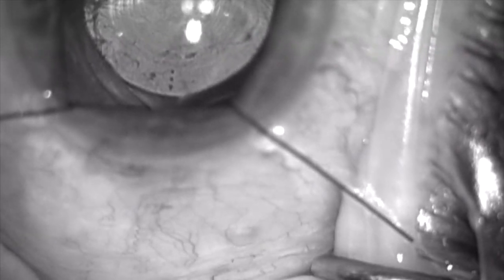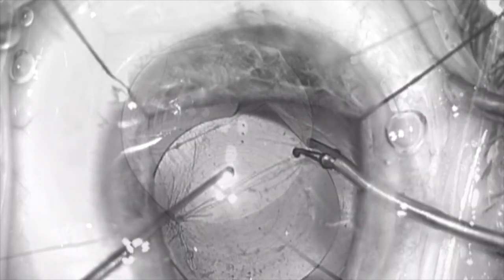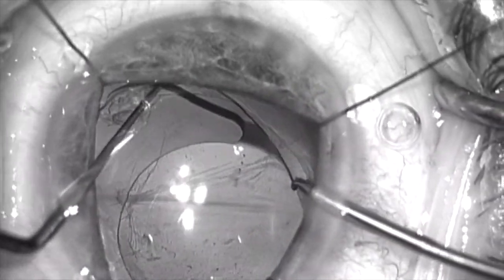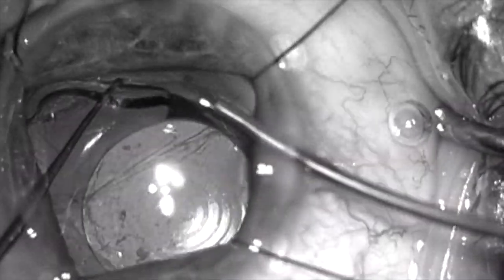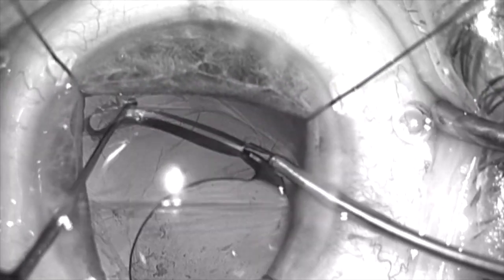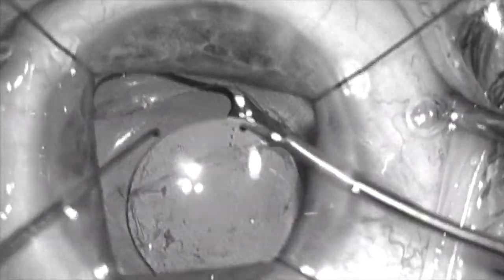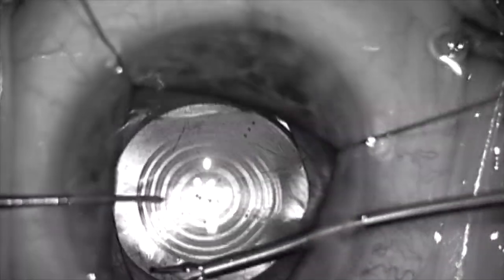So I'm going to go ahead and rotate the lens a bit to get it into a different axis, which means freeing up the haptic on the other side. Here I'm going to grab this haptic, which was within the capsular bag fornix and fibrosed in. And I'm going to very carefully tease this haptic and strip the tip, which is fibrosed right in the area where the radial tear extends out. I have to be very careful. And now the lens is able to be mobilized and rotated.